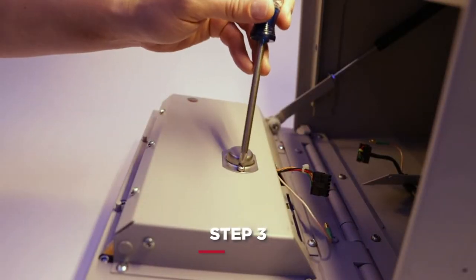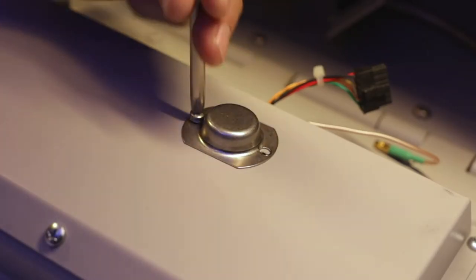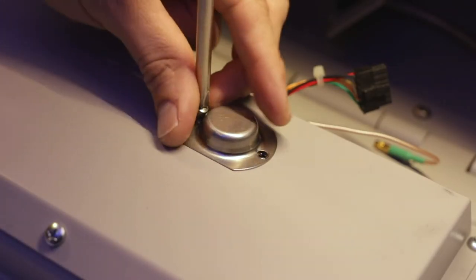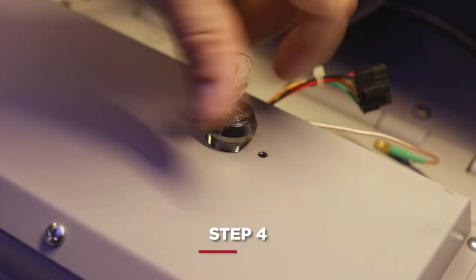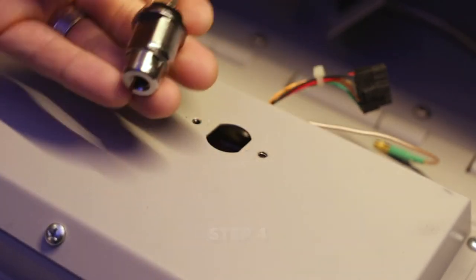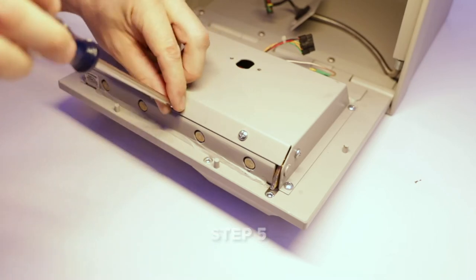Next, remove the two screws that secure the tech key cover. Use your Knox Tech Key to unlock the back cover. Remove the nine screws from the back plate using a number two screwdriver.